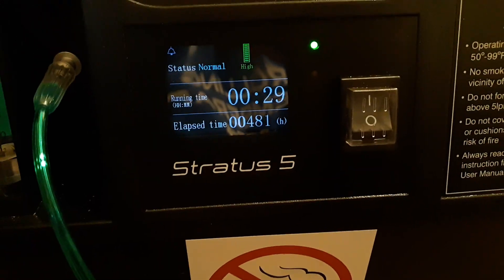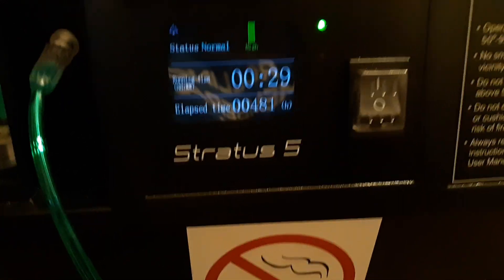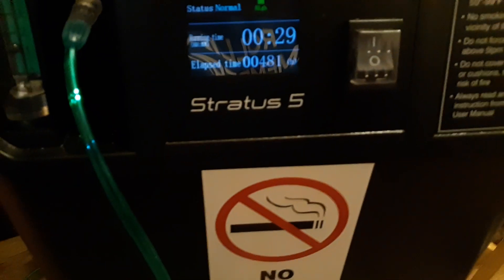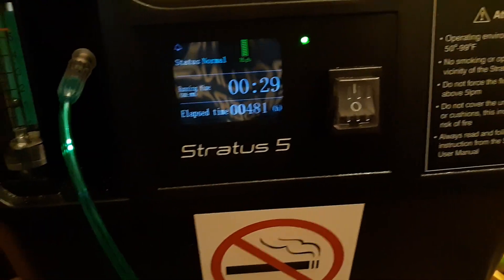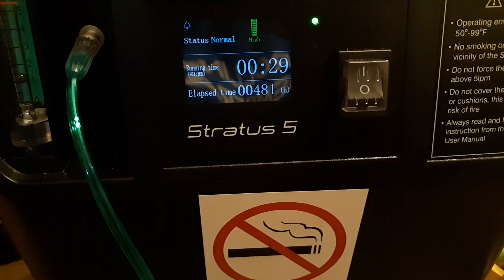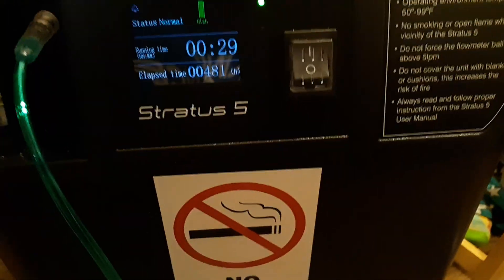Once it gets to red and low, there are several things you could do. Basically it means the air quality is bad — there's either a kink in the line, the filter is bad, or it could possibly be an error in the system. The first thing I would do is unplug it from the wall.